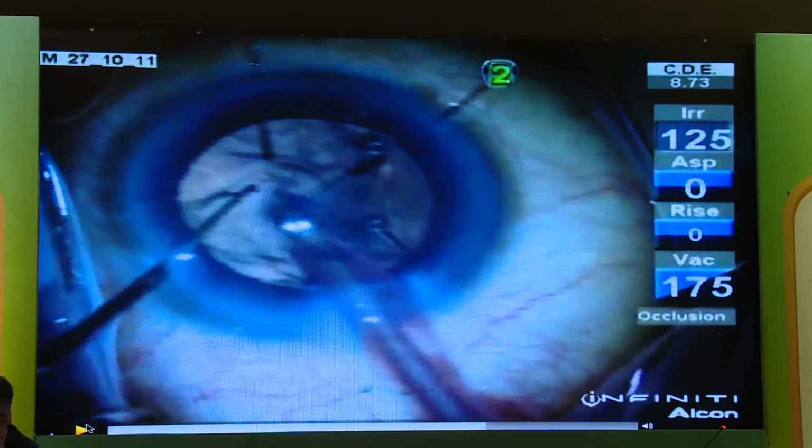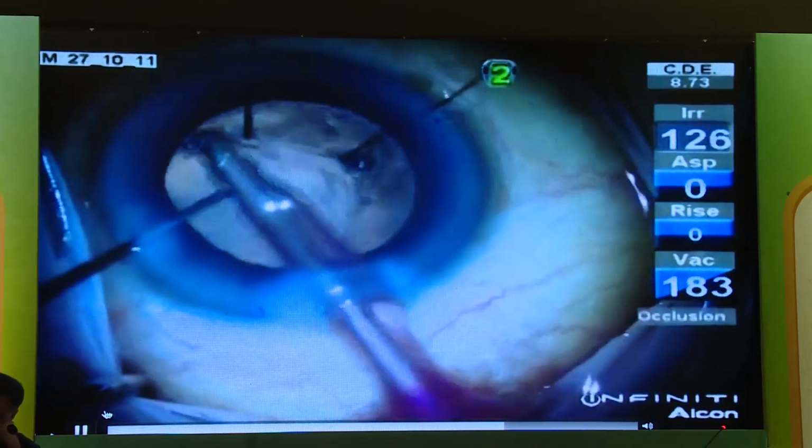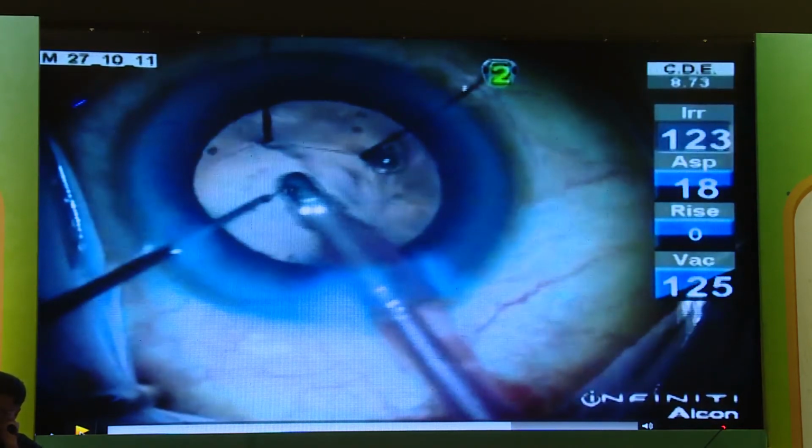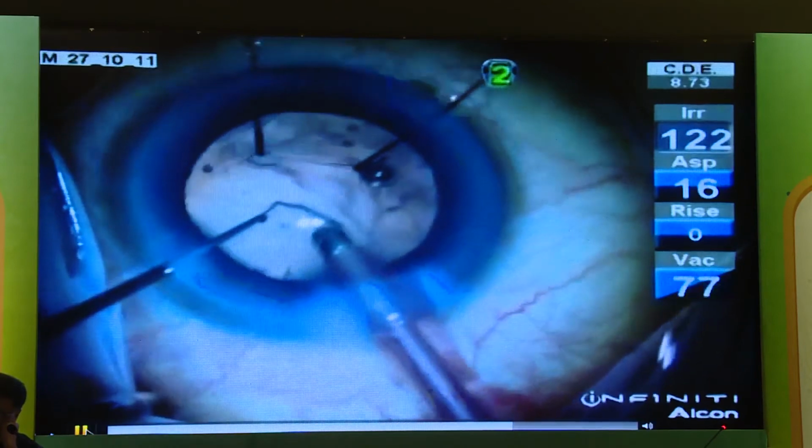And now aspirating this is a little difficult. As you know, the CTR would have definitely captured this. Remember where your eyelets were. Where the eyelets are, even if they are overlapping, from there you can tease out the initial part of the cortex. Once that is done, you can tangentially pull the rest of the cortex. Don't go here and there, one clock hour, then 6 clock hours away. If you pull like that, you will not get it. I'll show you in videos later that it is sometimes very difficult to get the cortex out.